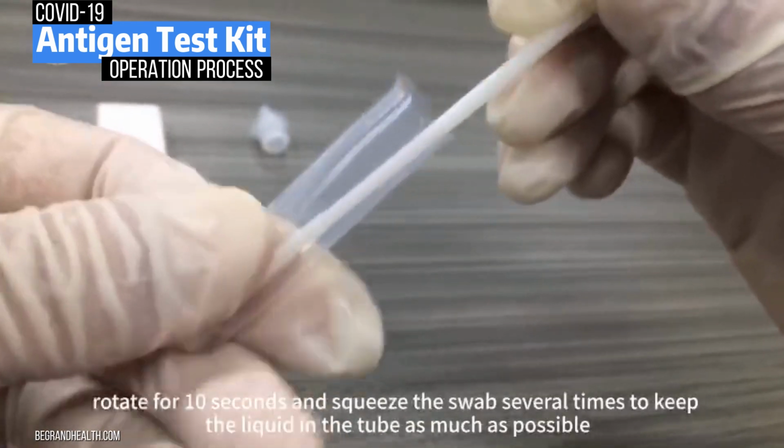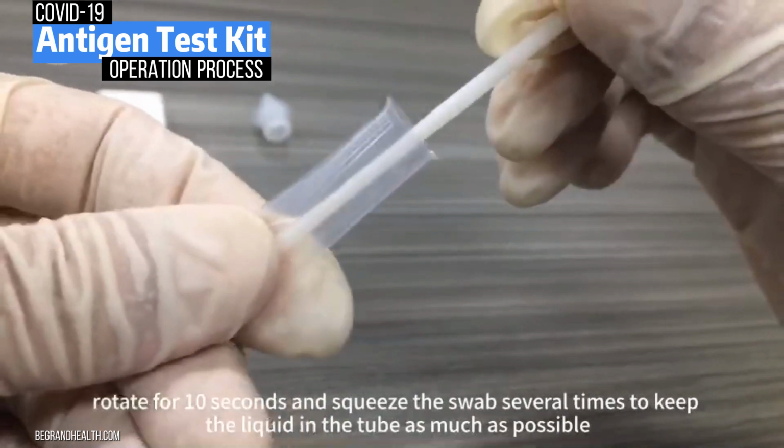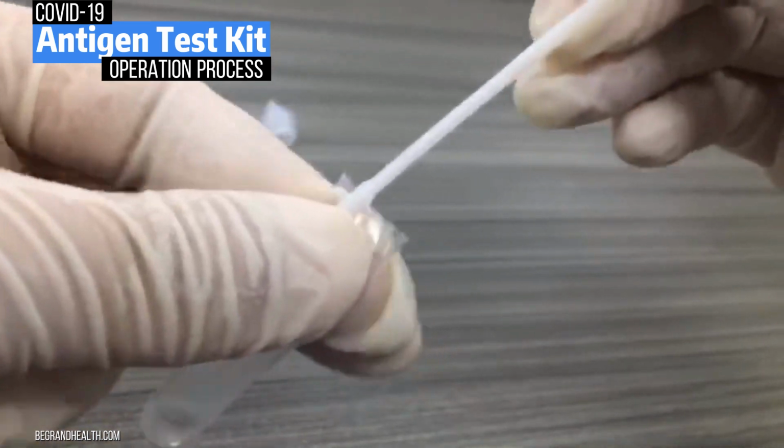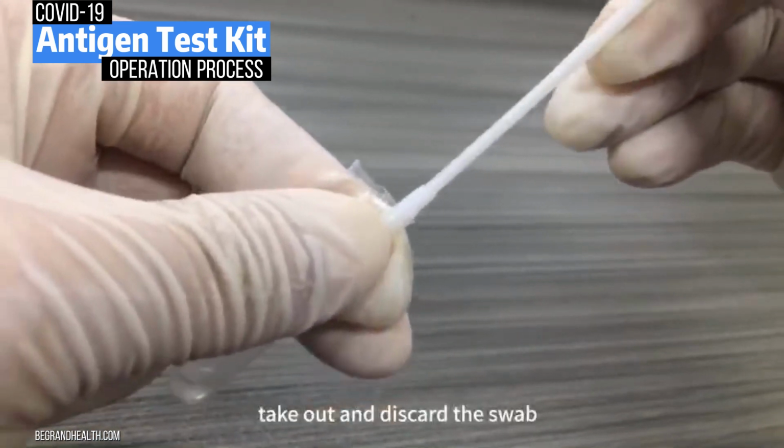Rotate for 10 seconds and squeeze the swab several times to keep the liquid in the tube as much as possible. Take out and discard the swab.